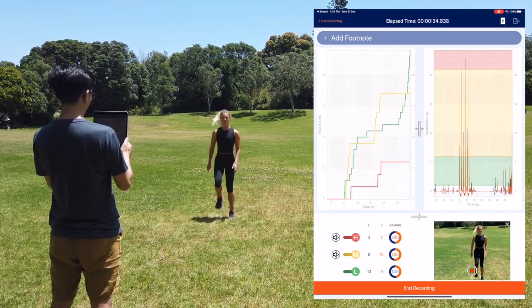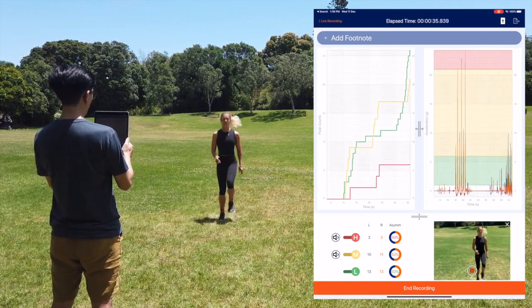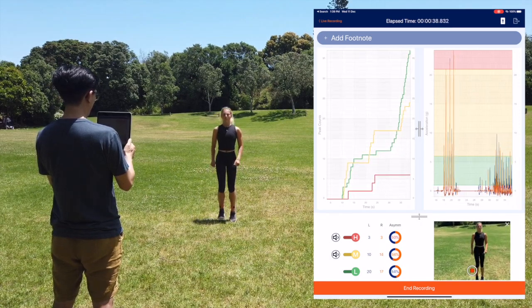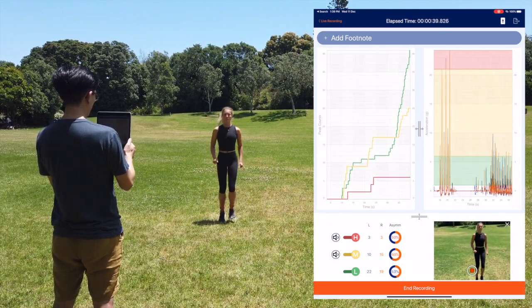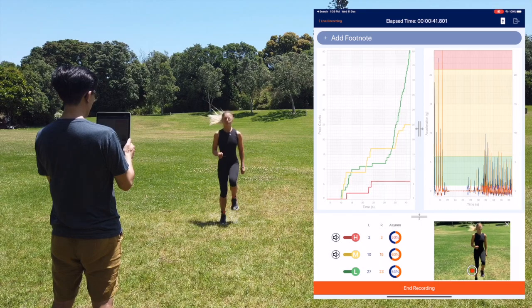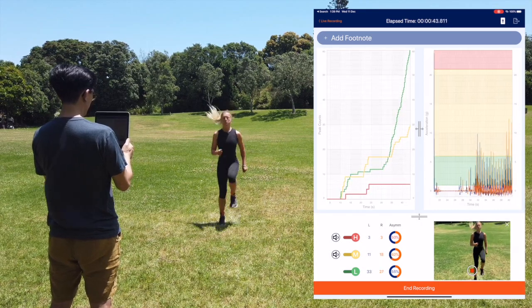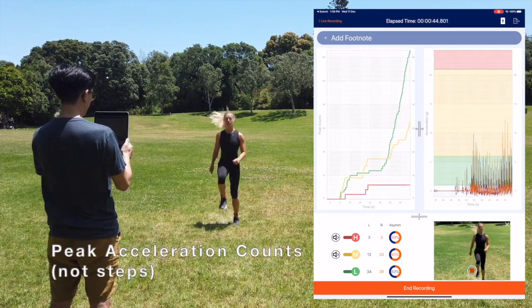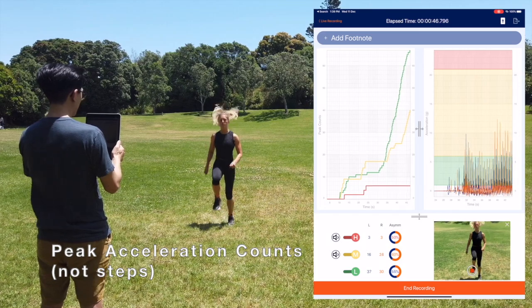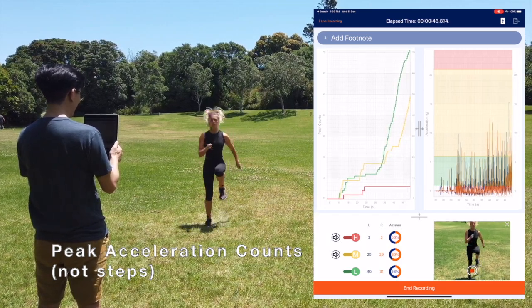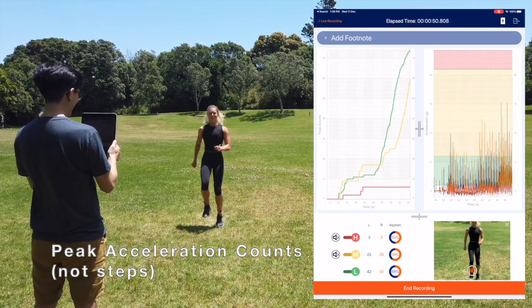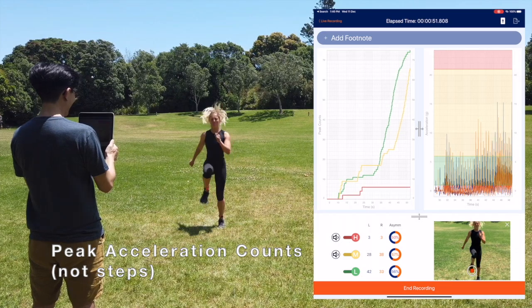These peaks are counted in the graph on the left hand side over the duration of your live recording, and these counts are displayed for each leg in the bottom left corner of your screen. It's important to note that these are not step counts, but simply peak acceleration counts, which may occur from any action, e.g. a toe-off during a counter-movement jump.